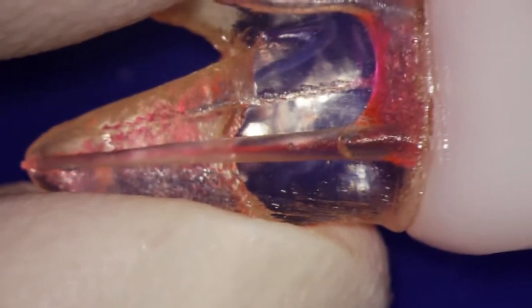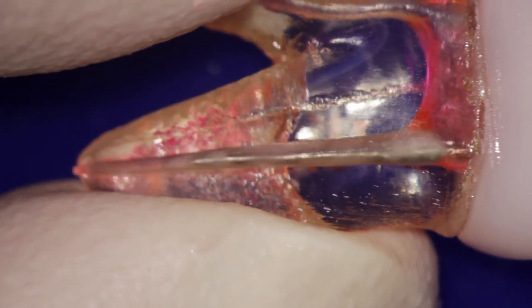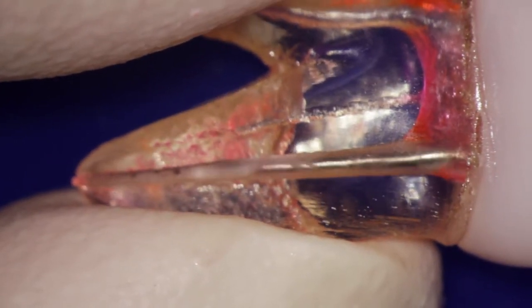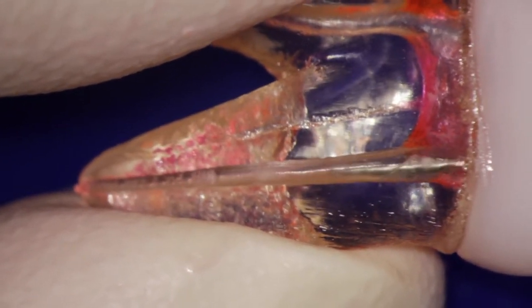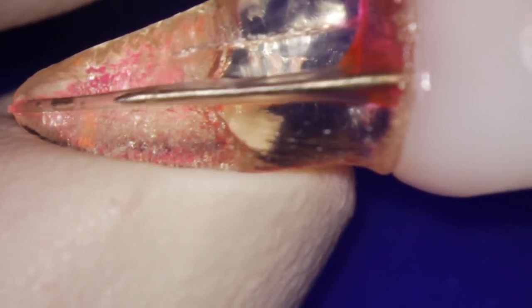Next is to show you the cavitation effect and the rise of bubbles in the canal. The canal was prepared with Profile until 40/06. The canal was flushed with sodium hypochlorite, and then an uncoated file was inserted in the canal and activated. Watch what happens here. The bubbles explode rapidly, but you can also see the airlock effect.